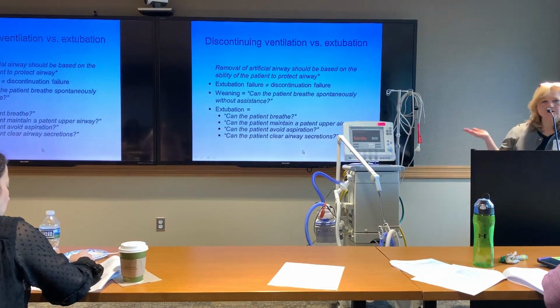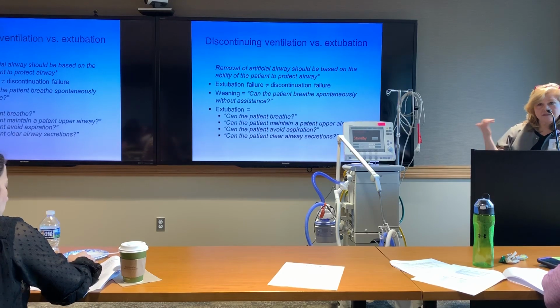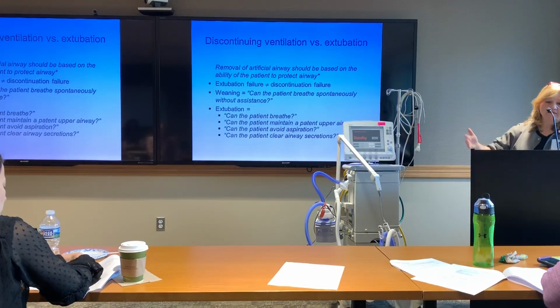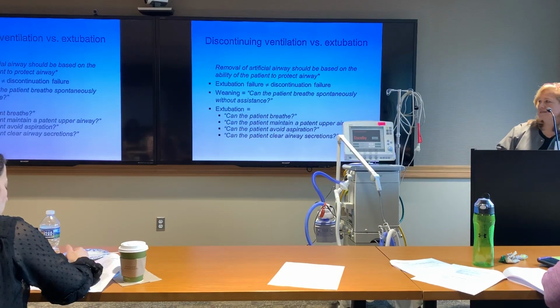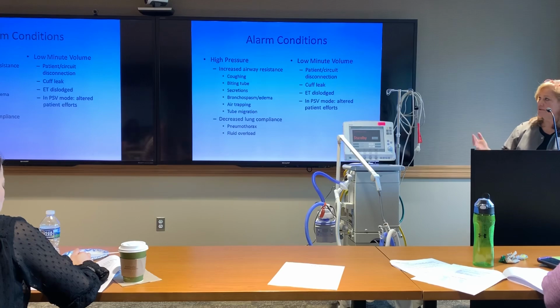if they extubate, or you think there might be a likelihood of extubation, sometimes we can extubate right to high flow or extubate to BiPAP. I would actually recommend high flow over BiPAP any day because it's just better tolerated by the patient, and maybe then wean them off of that if we're not 100% sure they're going to successfully wean. But obviously, if you can't maintain an airway, we're not even going to deal with that.